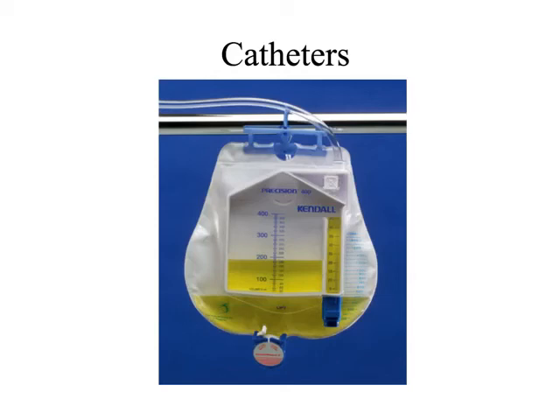Typically, the way that I've learned to work with that is I always have one set of hemostats hanging off of my scrubs right here. And if I'm working in a CT department, I'm constantly testing to make sure I got my hemostats on because I don't want them to wind up somewhere else, right? You can go to an Army Surplus Store or wherever, buy a set of hemostats, or if you're working in interventional, just borrow some that are there.